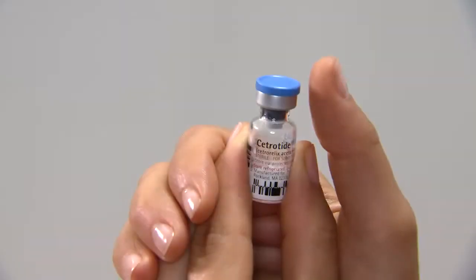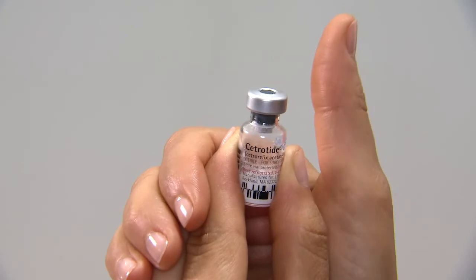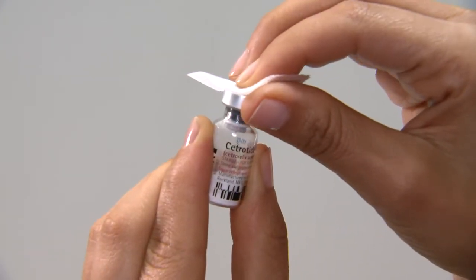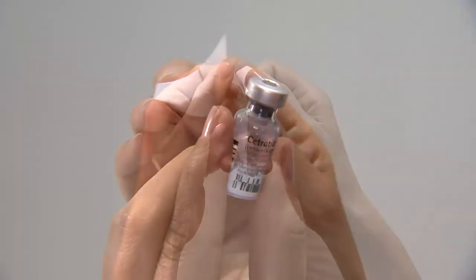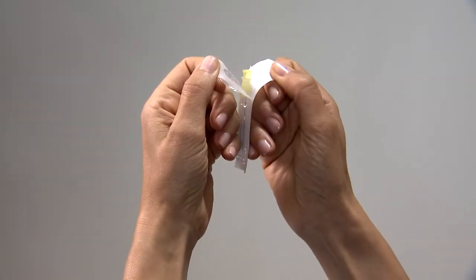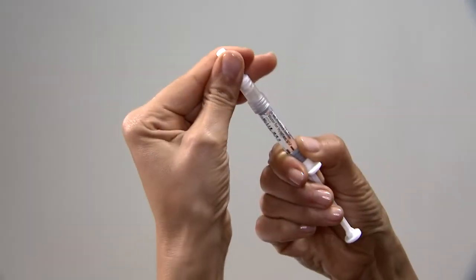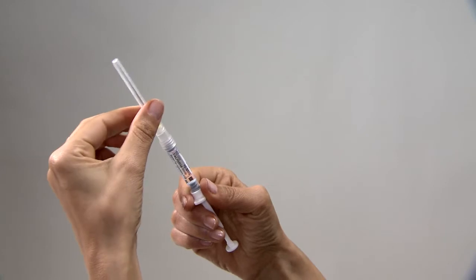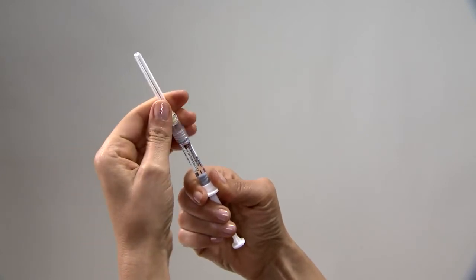Step 1. Mix. Using your thumb, flip off the protective plastic cap on the Cetrotide vial. Wipe the top of the vial with an alcohol swab. Remove the wrapping from the yellow mixing needle. Take the pre-filled syringe and remove the cover. Twist the yellow mixing needle on the syringe and remove the cover of the needle.